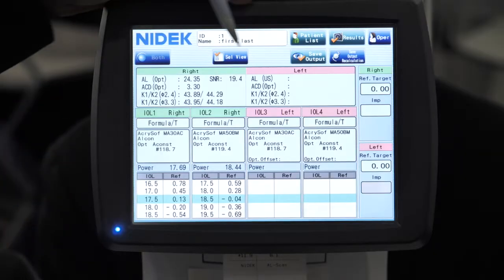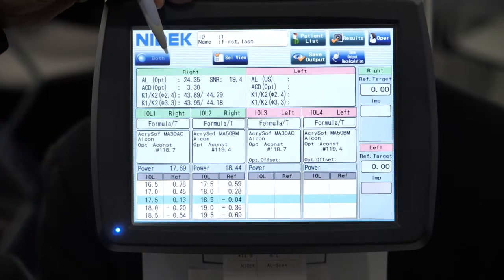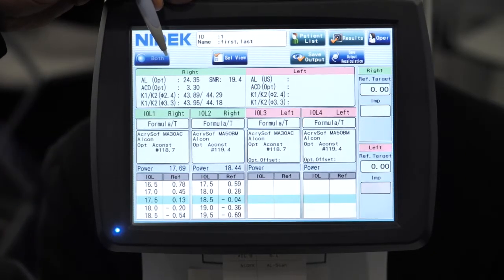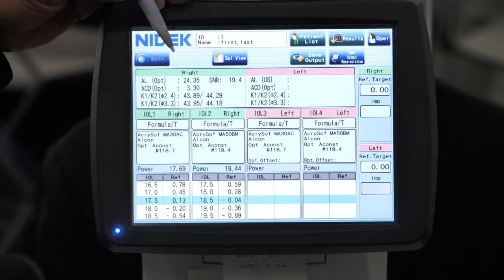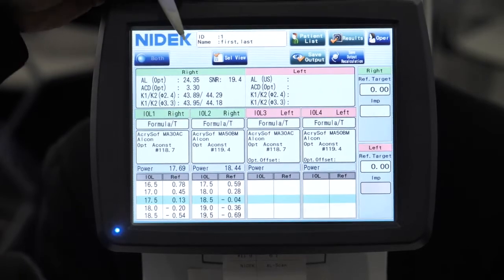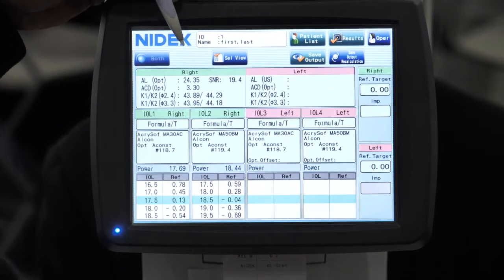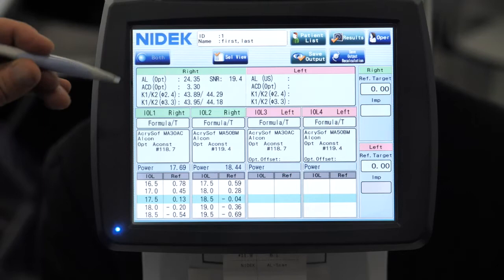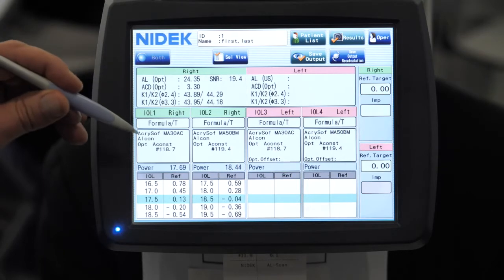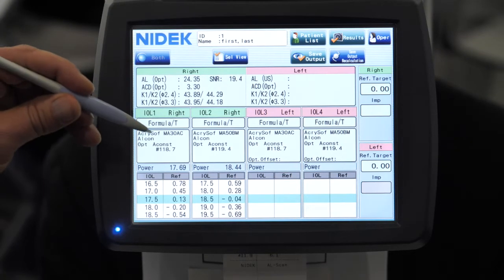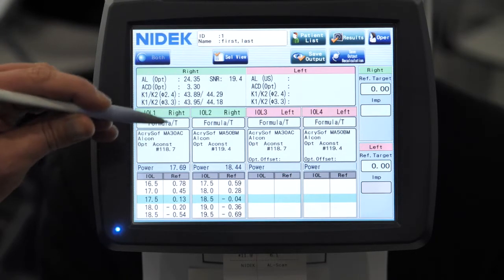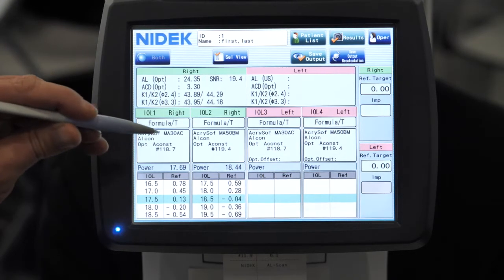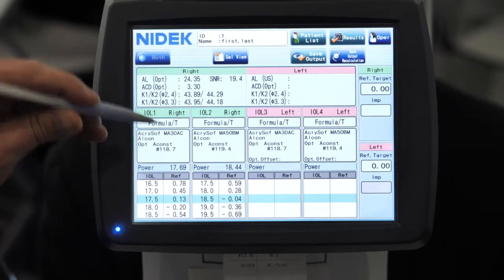As you can see here, it now populates the IOL calculation screen. We can customize this for each doctor in the practice, and we can have their most common IOLs that they select already preset in here for them.